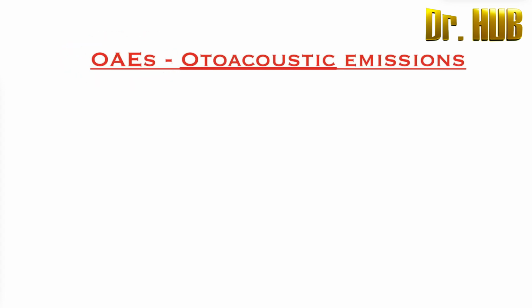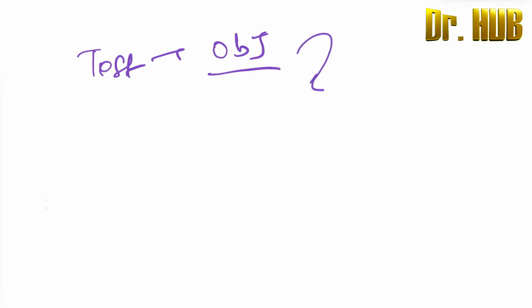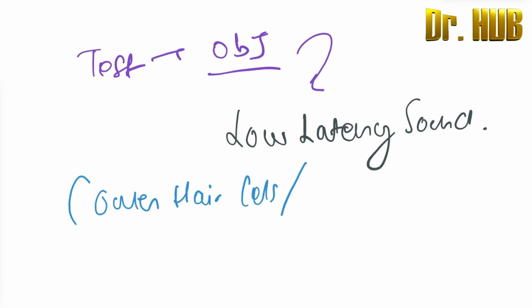OAEs, so it is nothing but the otoacoustic emissions. It is an objective test that records the low latency sounds, and these are produced by the outer hair cells of the normal cochlea.